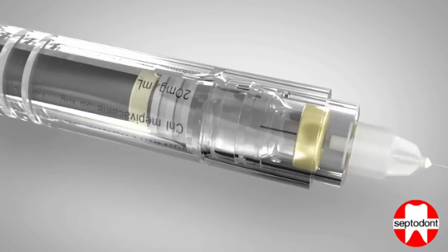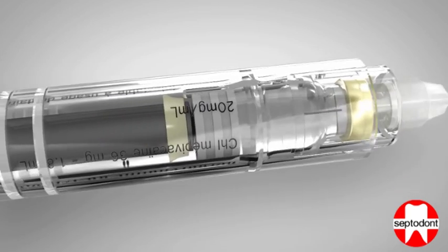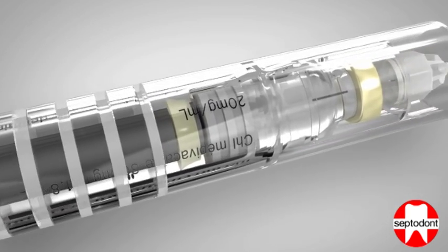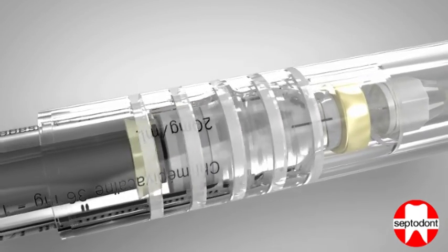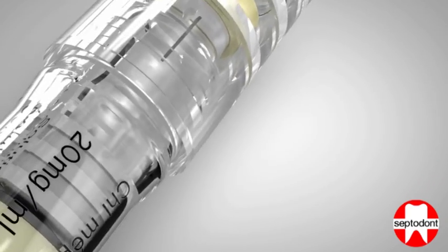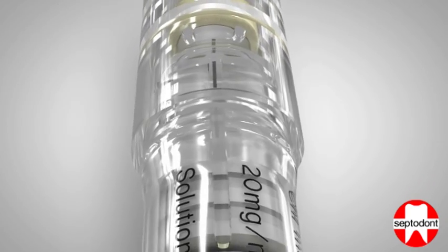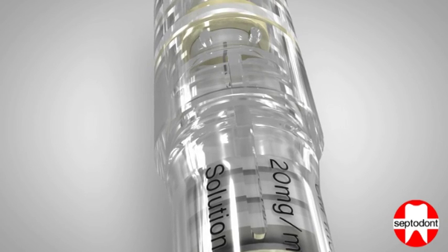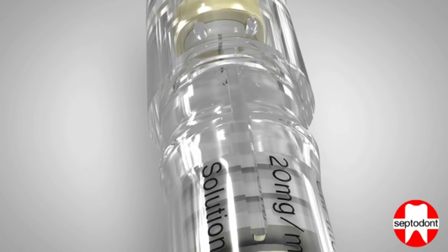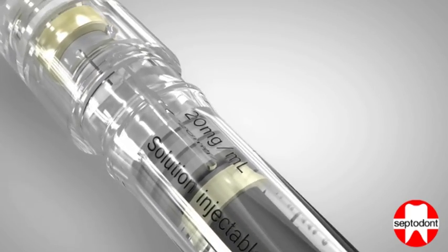After you have finished the injection, remove the fingers from the handle and grip the finger holder. Slide the protective sheath down the barrel of the syringe until you reach the first holding position. Then grip the barrel of the syringe and push the protective sheath firmly until a positive click is felt and heard.